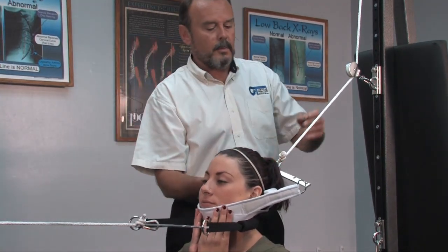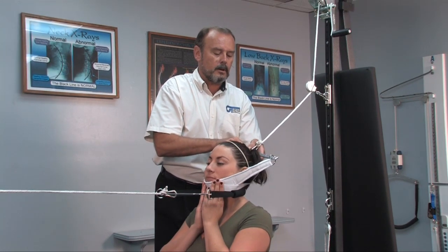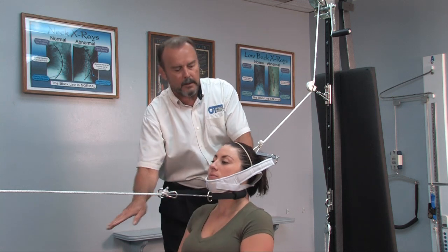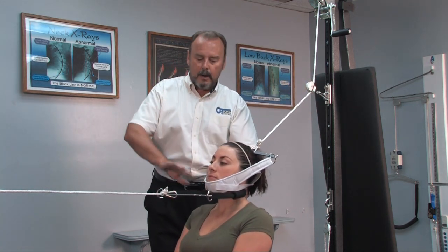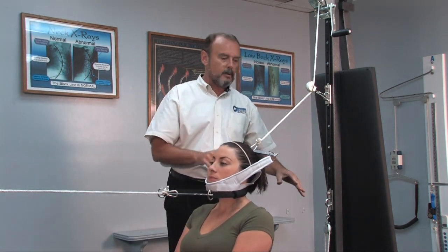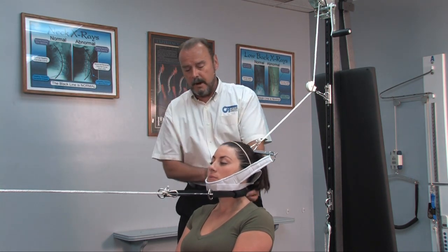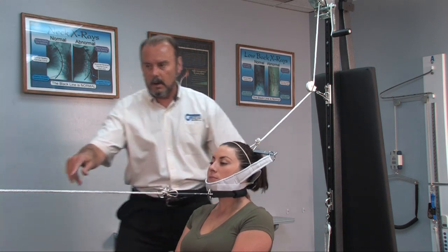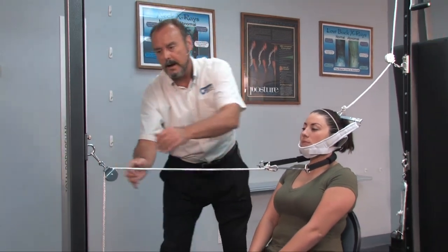Now, depending on your angle of front pull is going to determine the angle of your back pull. If I'm doing a lower cervical front pull, you want a higher back pull. If I'm doing a higher pull into her neck, then I would move this down lower to do a lower pull for the back pull. This setup is more for a lower neck pull, where we've got this pulling into the lower neck.